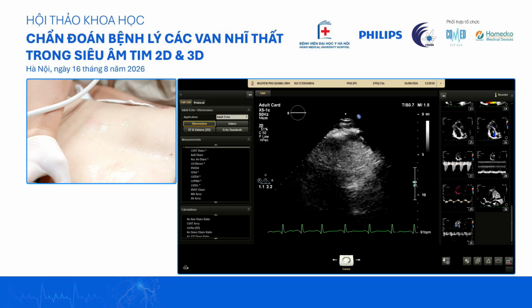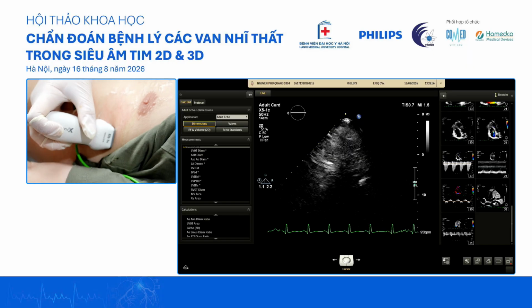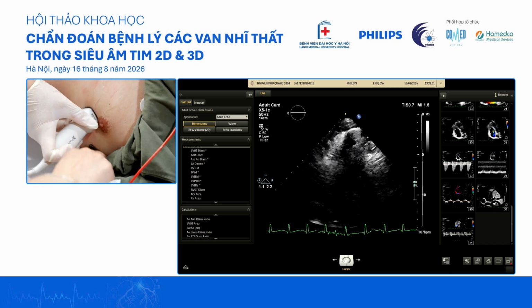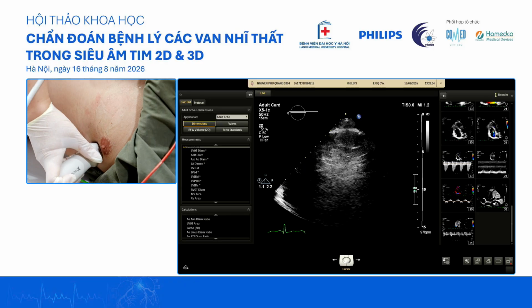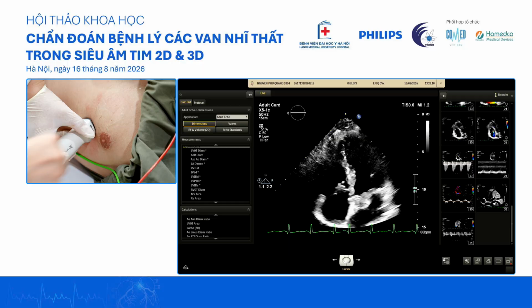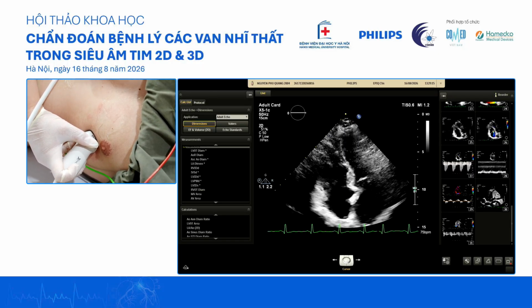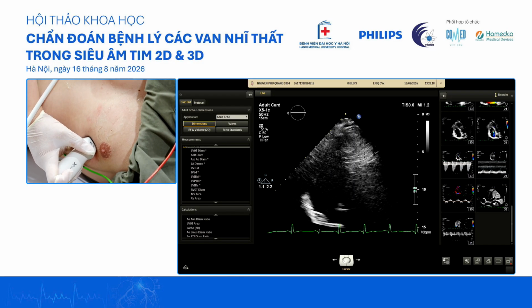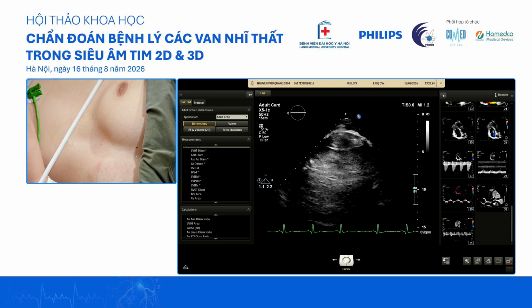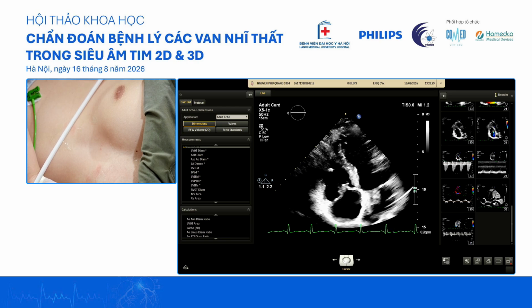And what do you want in RV volume in 3D? Sure. The 3D position of the tricuspid valve. 3D acquisition of the tricuspid valve. We do RV first and then. Okay, we'll do a RV volume. Để đánh giá thể tích thất phải 3D. So we usually get a RV focus view. Chúng ta sẽ dùng mặt cắt tập trung thất phải.